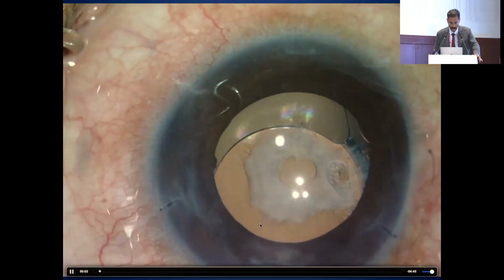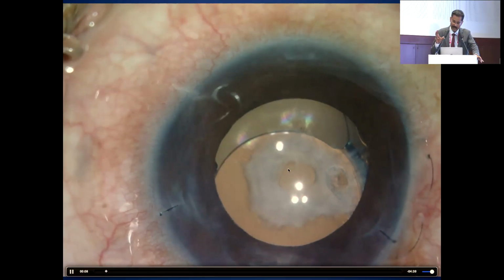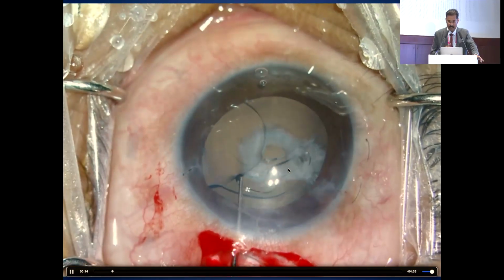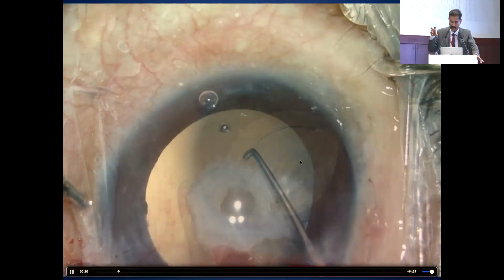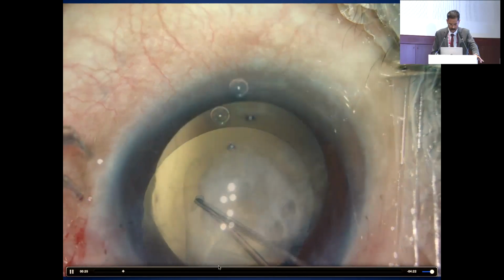Just to show you some, because we have five minutes more, this is one pediatric cataract. The lens was placed in the sulcus and left there. This kind of single piece lens gets decentered badly, and that can be exchanged, but see what happened to the rhexis margin. See the kind of fibrosis which happens and the adhesion of the anterior and the posterior capsule. I'm trying to release this, and it doesn't work at all.